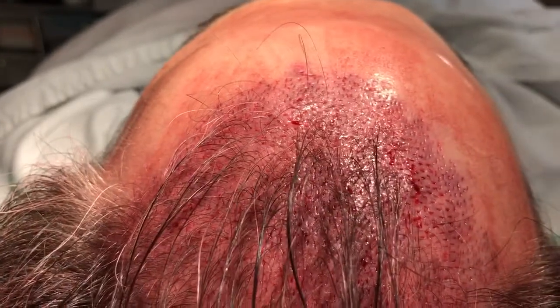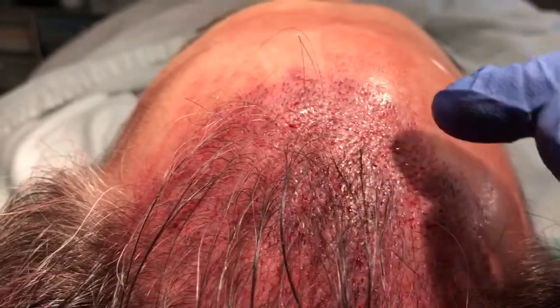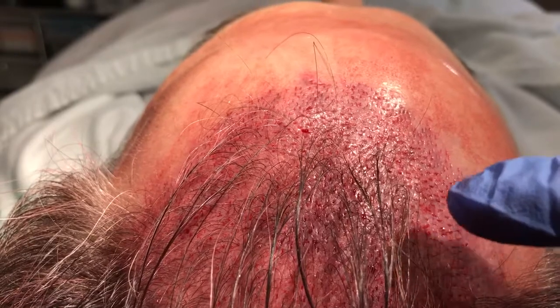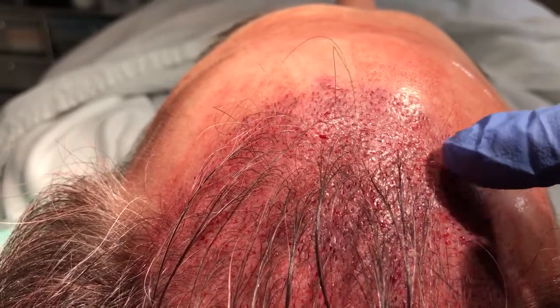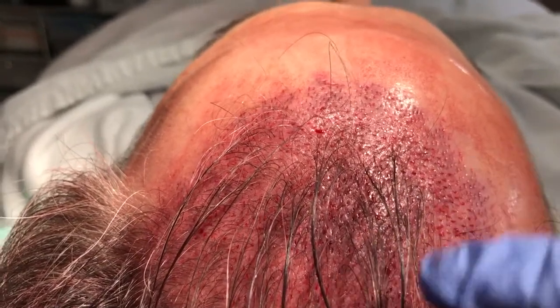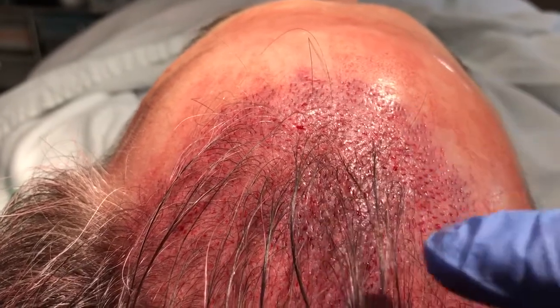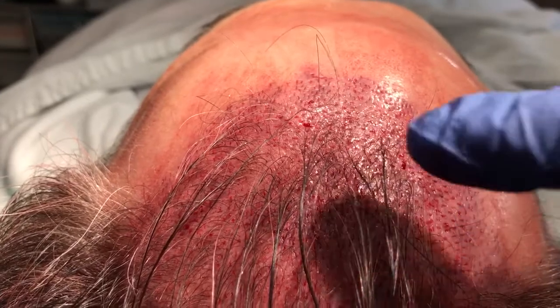The second thing is proper interlocking. This is one of those things that, as you do a lot of these sites, you start to do naturally. If you look, there are no holes between these parallel or sagittal sites and the coronal sites and back to the parallel sites. Oftentimes when you make this transition, it's very easy to leave little holes because the pattern changes. So you want to make sure that there's no hole there, so there are no gaps.